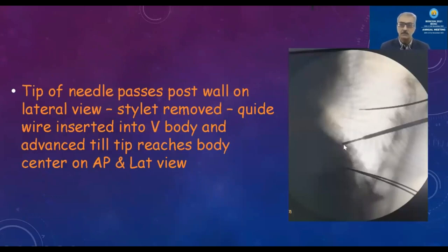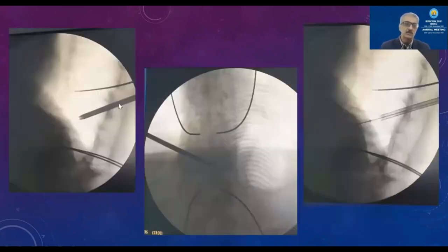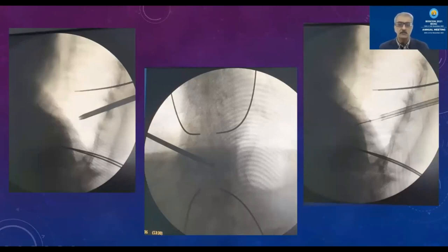Once the tip of the needle passes the posterior wall, the stylet is removed and the guide wire is placed in the center of the vertebral body, confirmed in both AP and lateral views. The cannula needle is removed and the working channel is passed over the guide wire, penetrating the posterior cortex. Through the working channel, the reamer is passed to smooth the edges of the bone so as to prevent bursting of the balloon.